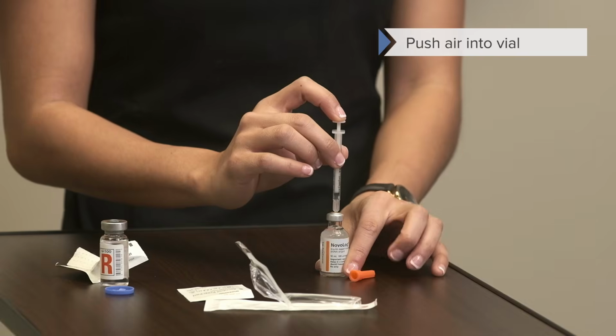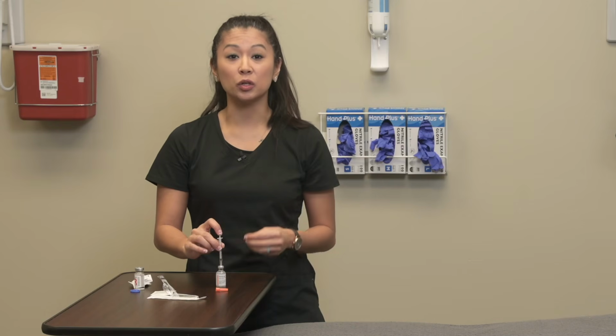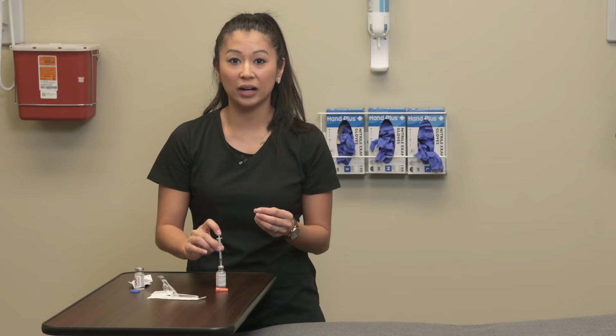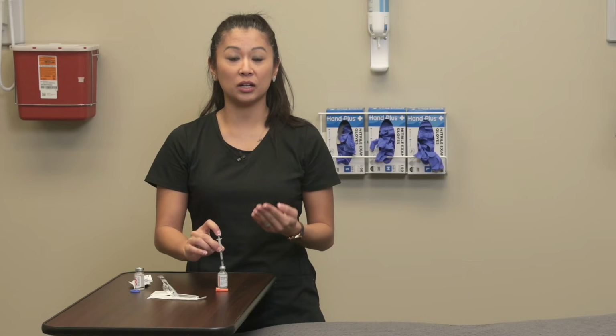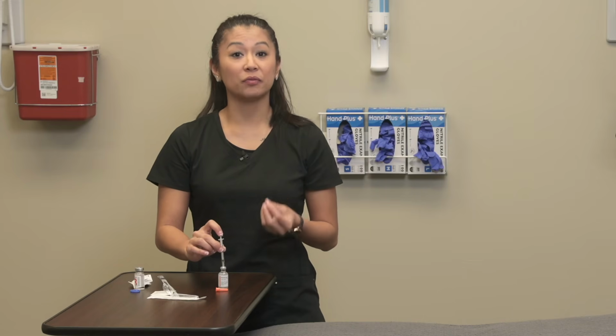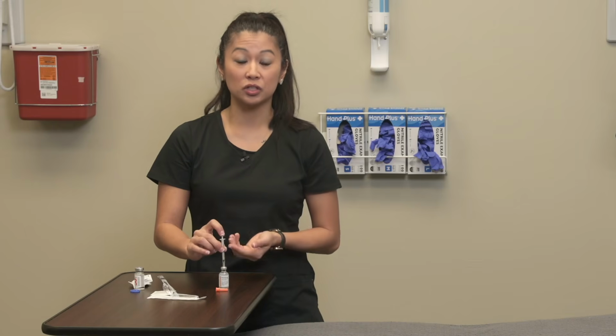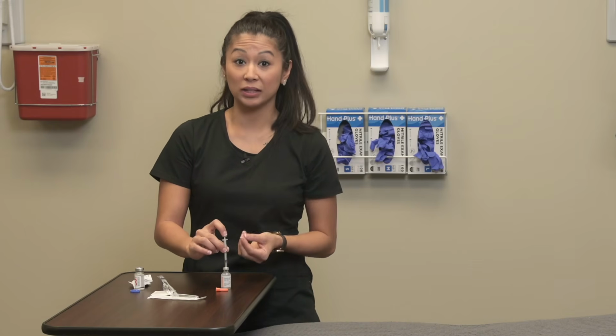Now, there's some debate about this. Sometimes your nursing instructor may tell you you need to put the exact amount of air of the exact amount of medication that you're going to draw up. Really, the purpose of this is just to make sure that the medication pulls back smoothly. It helps provide that pressure to fill the syringe when I turn this over to draw up my med. So that's really up to you.